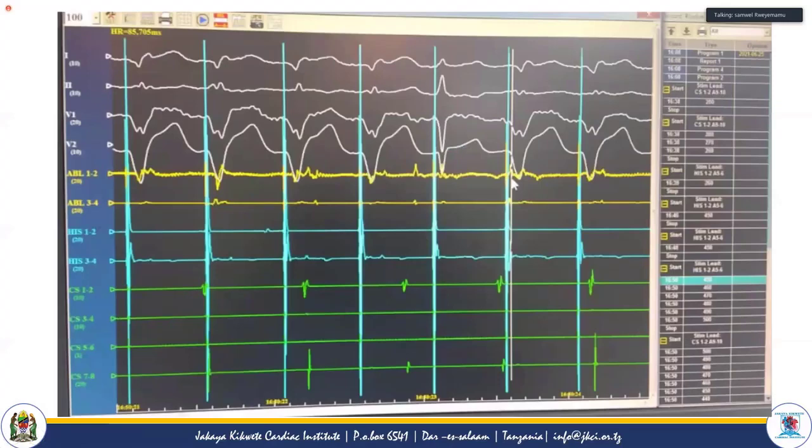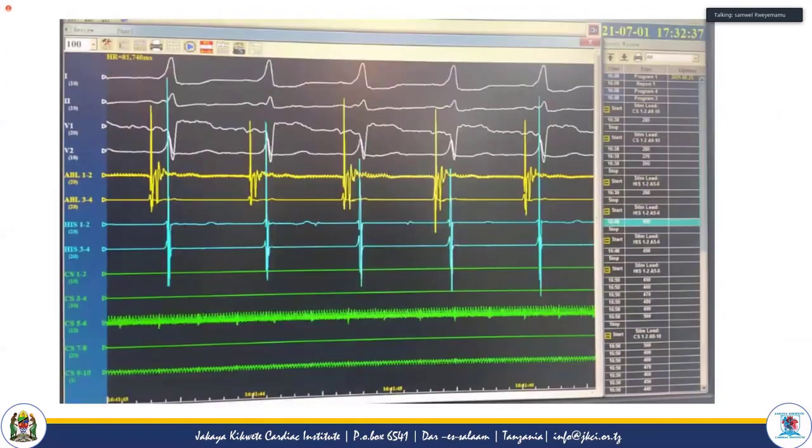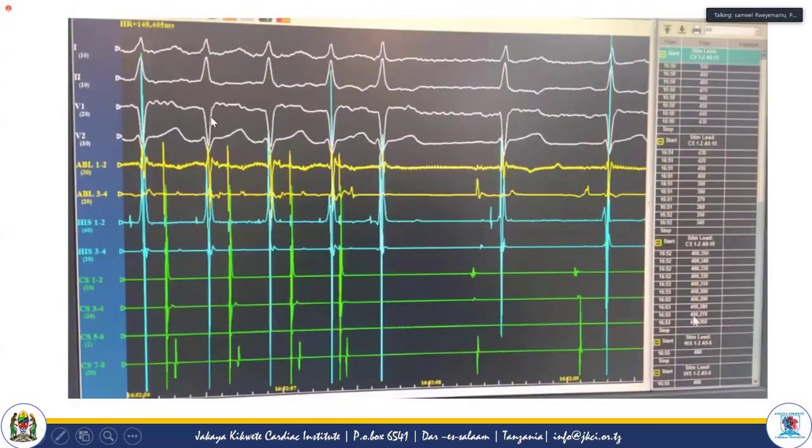So this slide is showing to you that this patient. I want you to show us the successful ablation site because this is pacing post ablation. I'm sorry, I did not take the cine from this for this patient. Not cine, the intracardiac. Yeah. So the intracardiac, I can show you is this. Okay, one. This is after ablation.